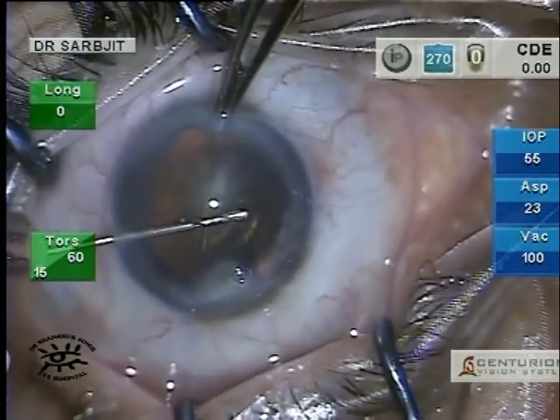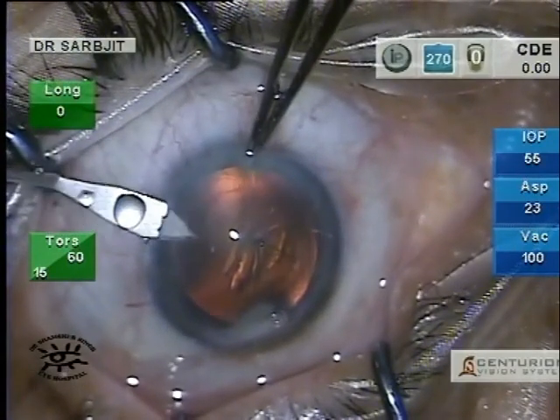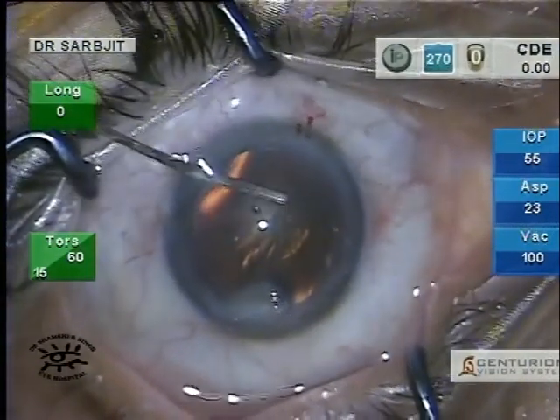We aim for a 5.5 to 6 millimeter rhexis. Once the rhexis is done, I do a 2.2 millimeter main incision. Once the incision is done, hydrodissection is performed.